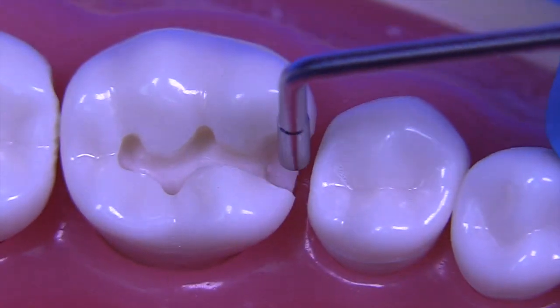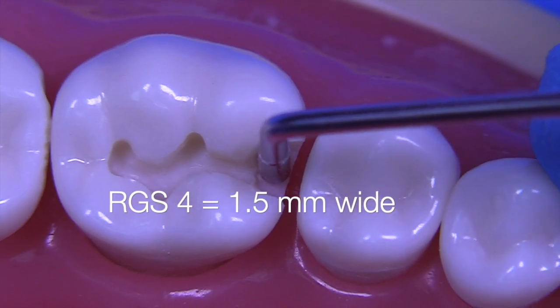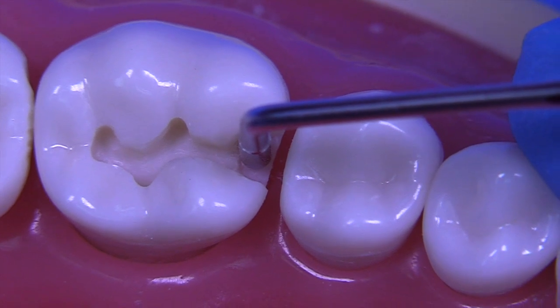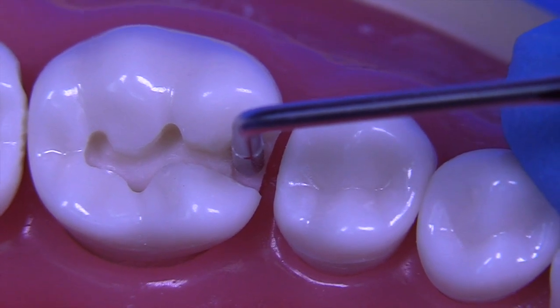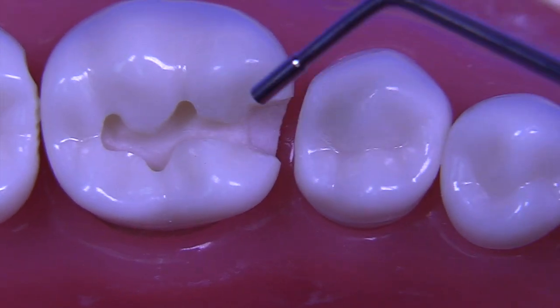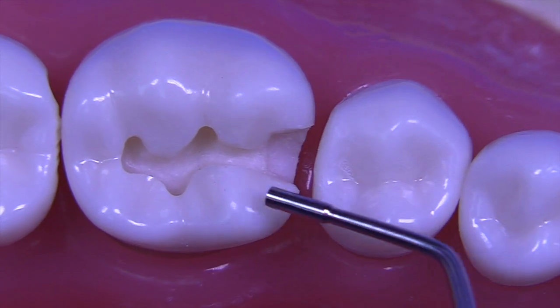Another way to check it would be with the RGS 4, which measures 1.5 millimeters in diameter. And you can see that you're clearly more than 1.5. And also, if you notice, there's an angle to the wall. So you're deeper axially on the facial side compared to the lingual side.